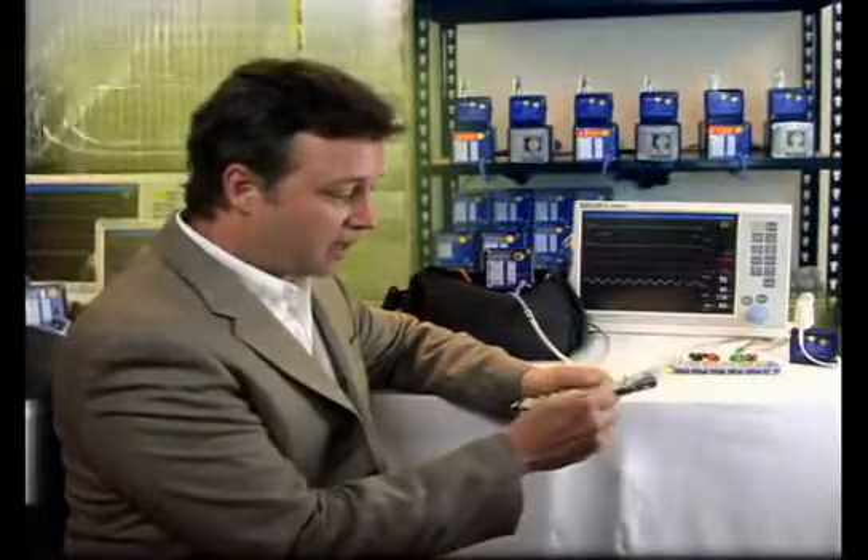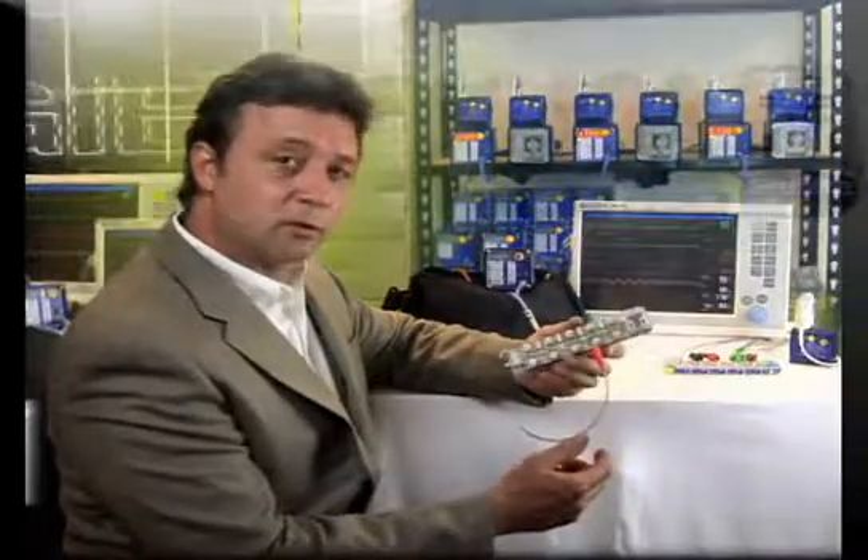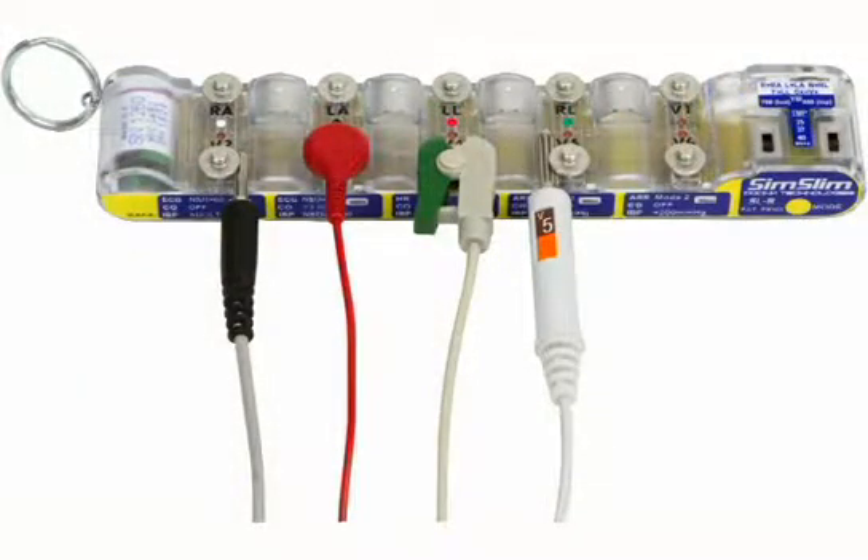Some amazing things about the SimSlim: if you're dealing with EKG carts in the hospital and trying to get a good connection to simulate a diagnostic EKG, a great patented idea for the SimSlim was the banana plug interface. All you have to do is slide the banana plug into the body of the simulator and it makes solid contact with the ECG snap.